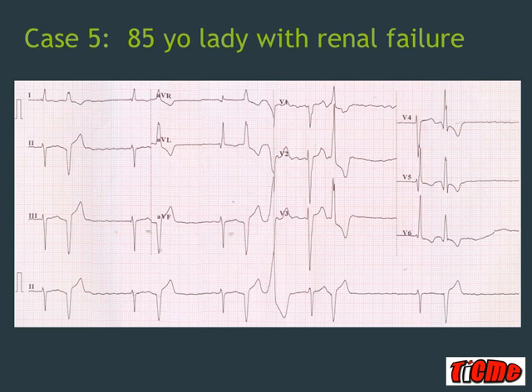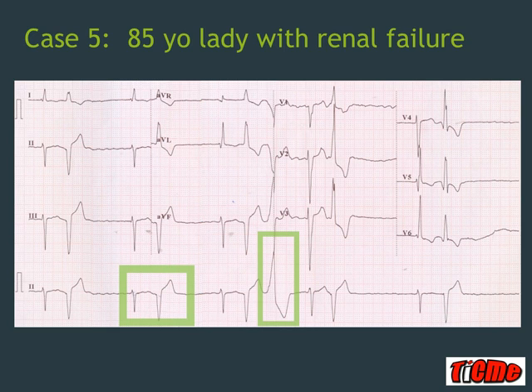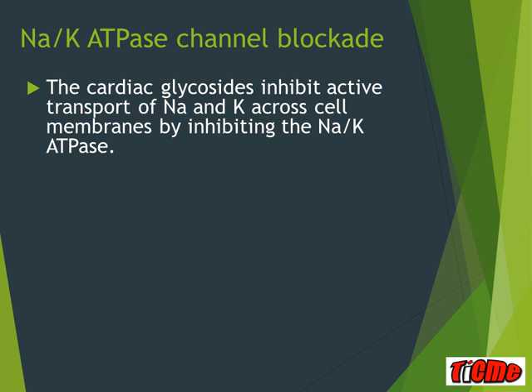Case 5: an 85-year-old lady with renal failure. Her ECG is regularly irregular, showing a narrow complex beat followed by ventricular ectopics — multifocal ventricular ectopics — and a non-isoelectric baseline with a wobble, most likely slow AF with multiple ventricular ectopics. This is absolutely classic for digitalis toxicity: sodium-potassium ATPase channel blockade. The cardiac glycosides inhibit active transport of sodium and potassium across the cell membrane.